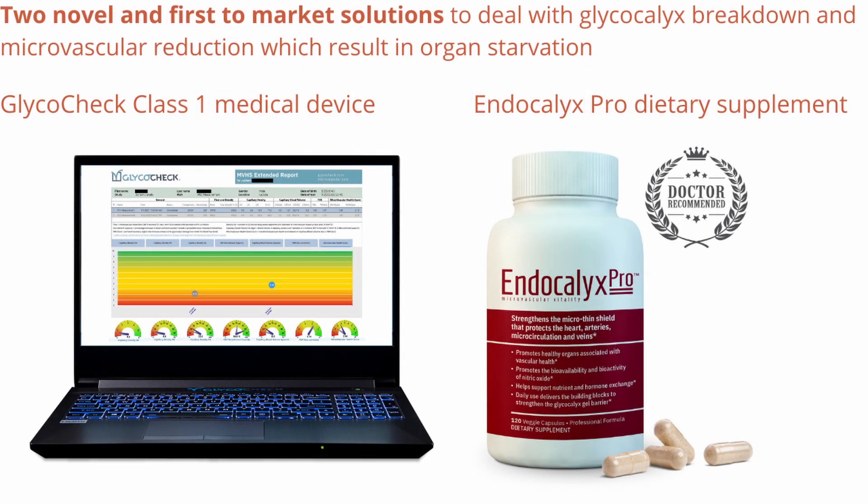Today we'd like to focus on the GlycoCheck device. The GlycoCheck device is a biomedical device that we've developed over the years using a small handheld intravital microscopic camera that you can insert in your mouth to image live motion of red blood cells flowing through the smaller capillaries. Together with the GlycoCheck software, as displayed on the screen, you can now fully automatically analyze all these images and analyze the health of your microvascular system by counting the number of small vessels.